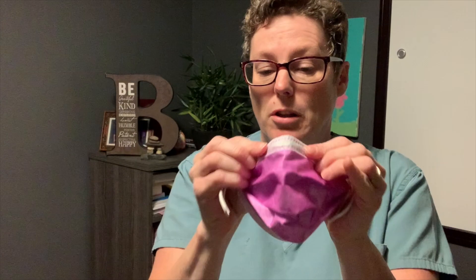Grabbing your nose piece, you can form that ahead of time or you can form it as it's on. Under the chin, loop the ears.